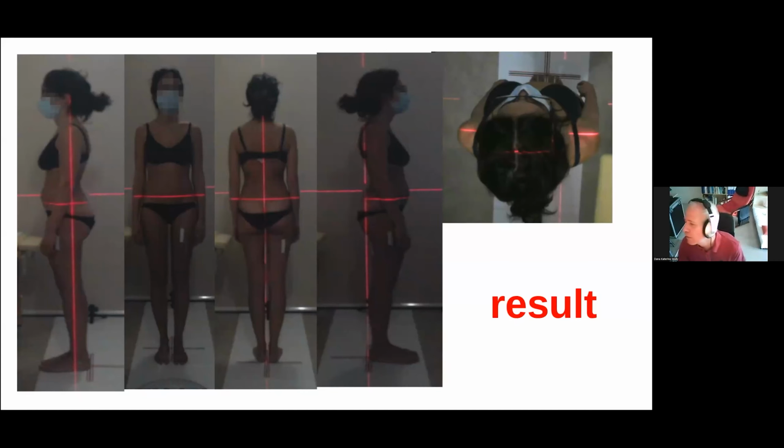Note that lasers are not powerful enough to be dangerous, but we have preferred to have further safety for the patient.